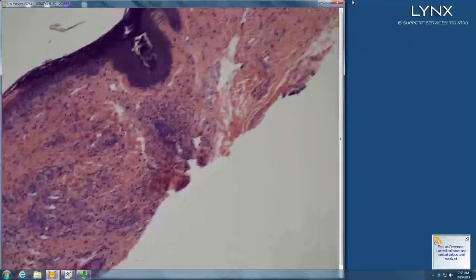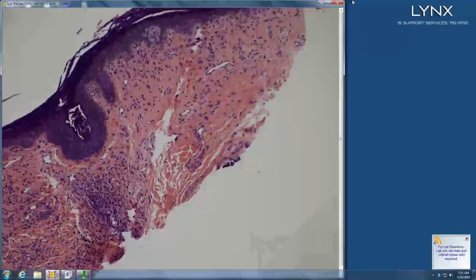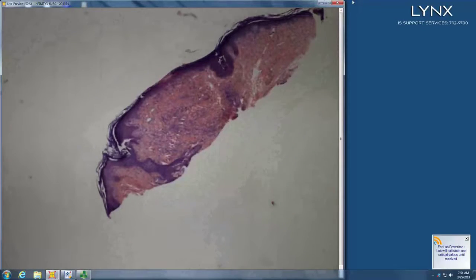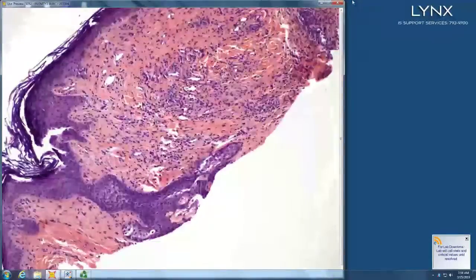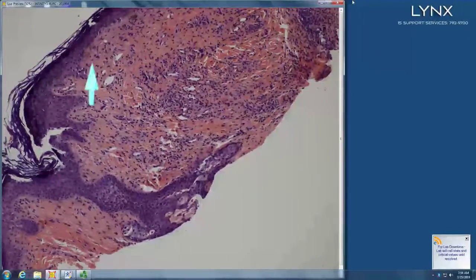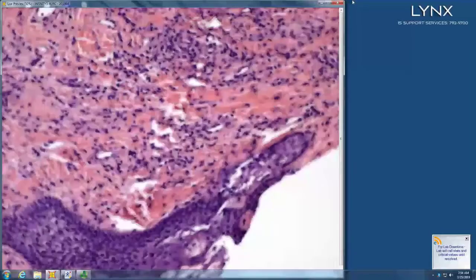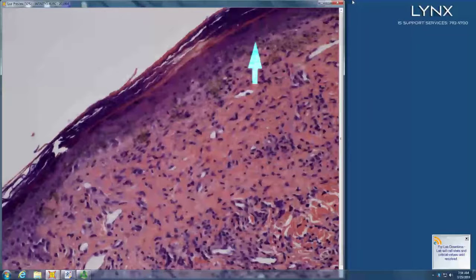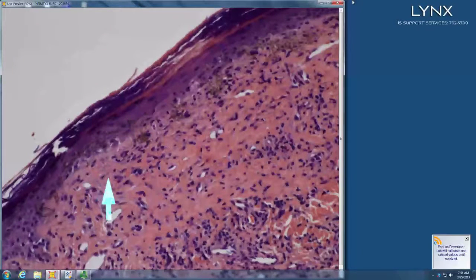Well, maybe I can imagine it's clawing around there. Like a ball and claw, but not exactly characteristic. Looked like there's maybe some pigment incontinence in it. Yeah, so some pigment incontinence, and actually a lot of that apparent pigment is formalin pigment, means that your formalin buffer didn't work very well, right? So you got formalin pigment there.